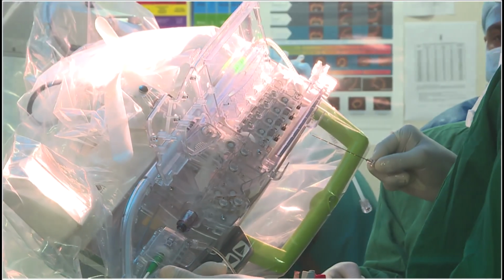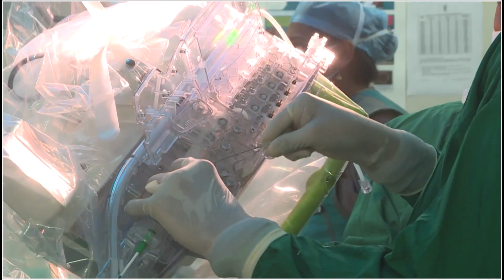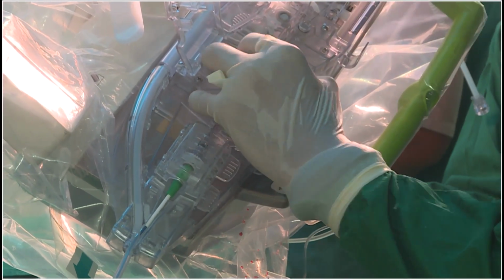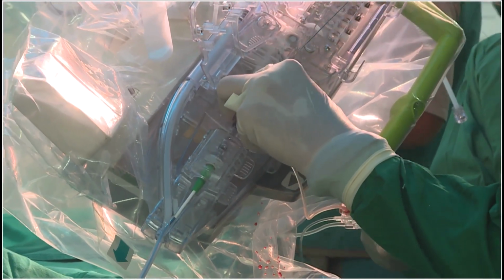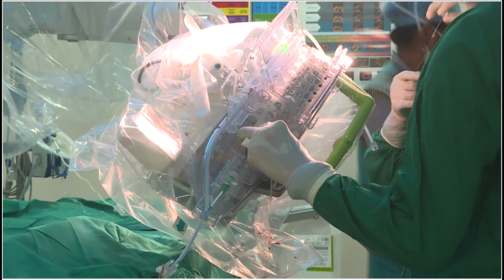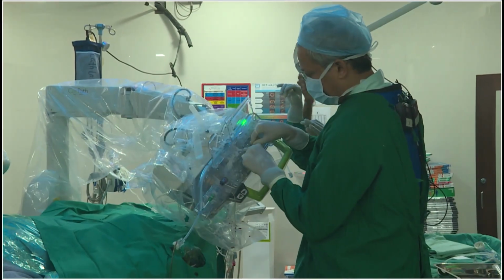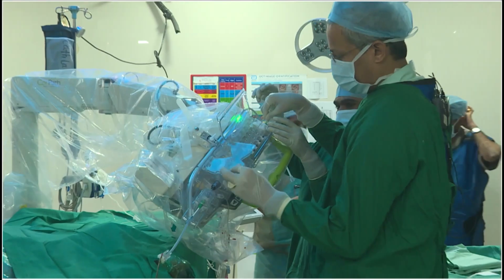So we'll just move the nozzle, so that will allow us to have access to the co-pilot. We'll put a wire over there with an angioplasty needle. There is a slot over here. We push the needle, then remove the needle. Wire open. Right, so there are rotary knobs over here. We have to place the guide wire accordingly, and we have to close the doors.